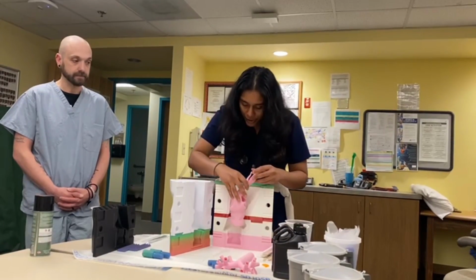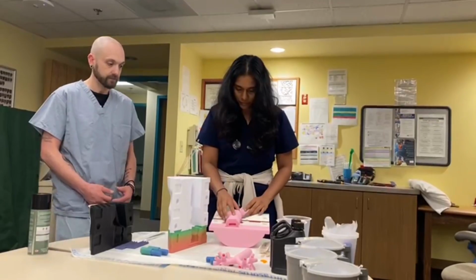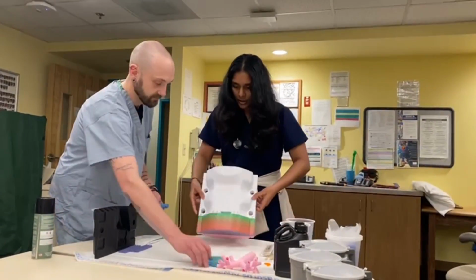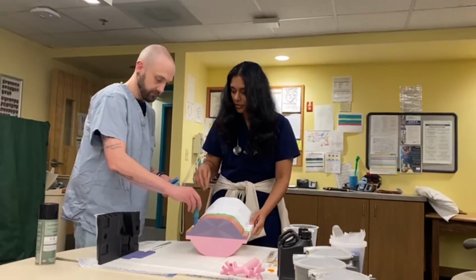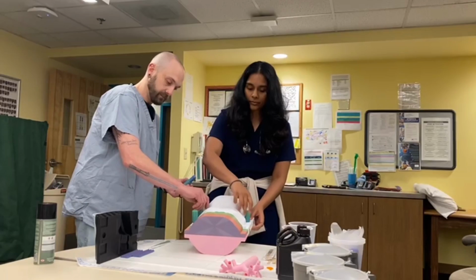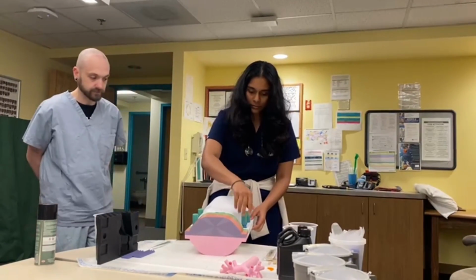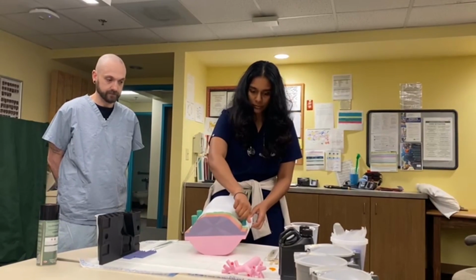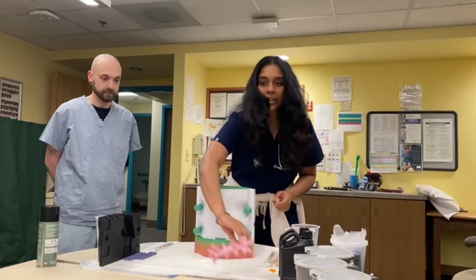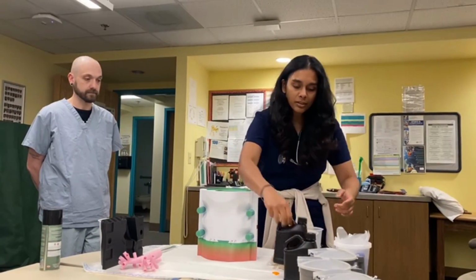To make the model over here, first we're just going to place this inside. Got 4 easy screws that can just be screwed in to secure the mold. We'll be setting the tracheal part aside, and the main mold here that we're creating is we're using silicone rubber.